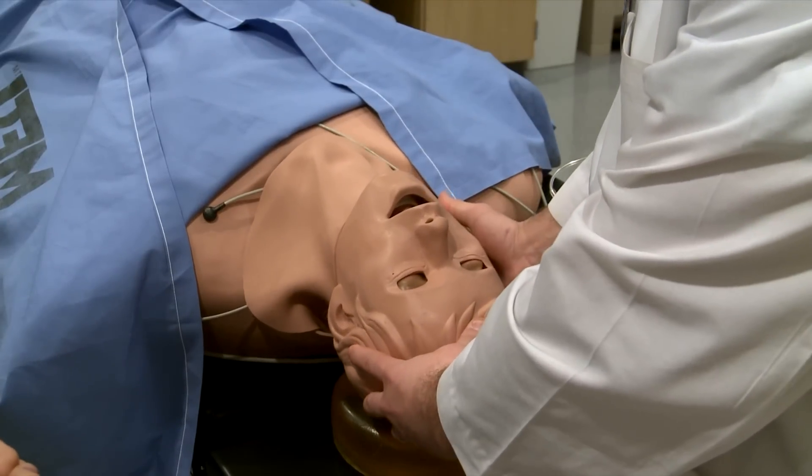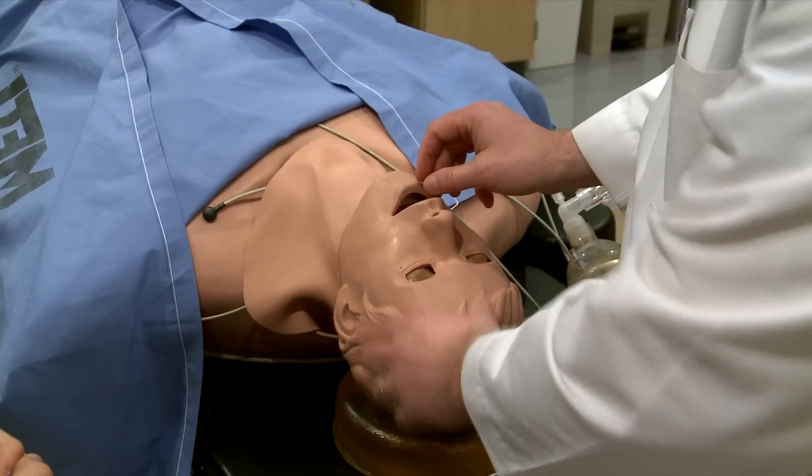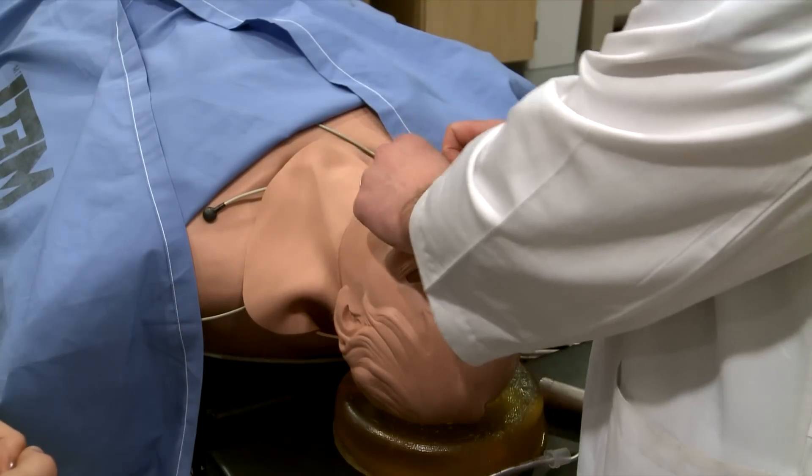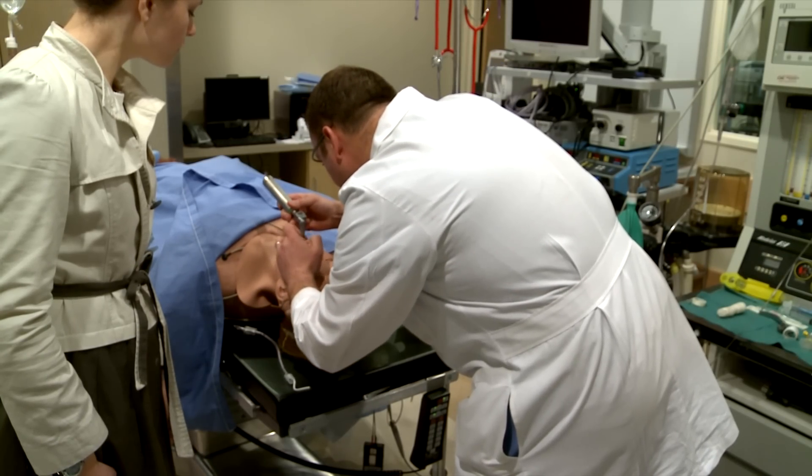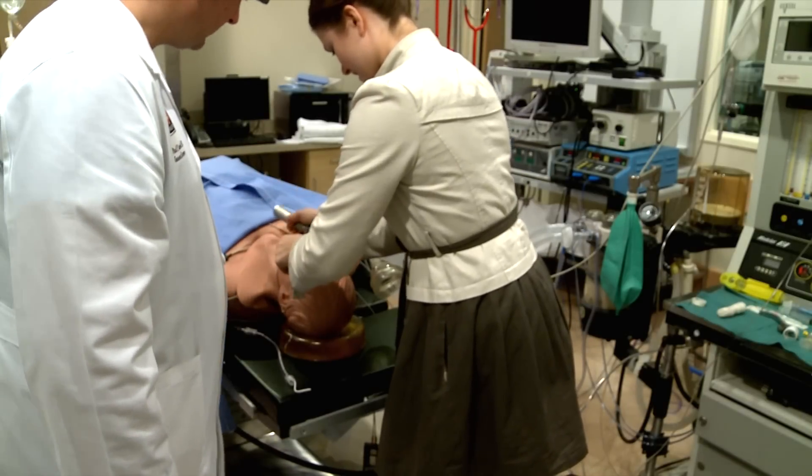One of the things you want to do is position the head back. Zotek taught me how to intubate, or insert a breathing tube into a victim, by walking me through the steps on a mannequin. But the first time around, I didn't do very well.